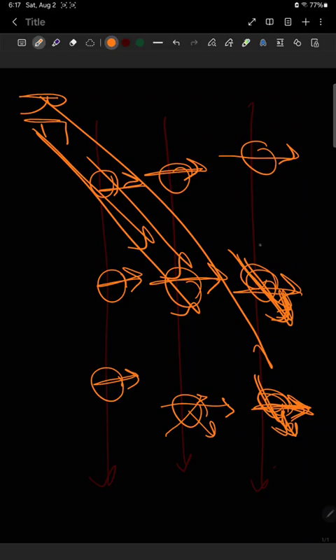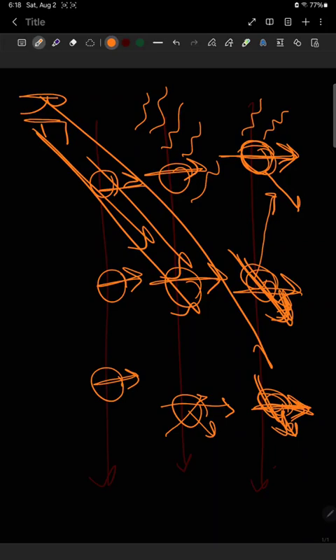That means they go back to the initial state they had under the external field. When they do that, they emit signals. This is the signals they emit when they go back to their alignment with the external field.